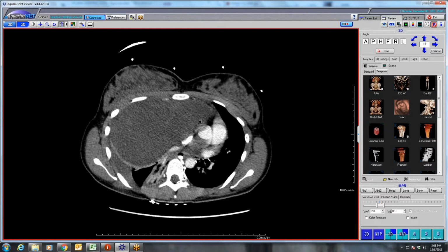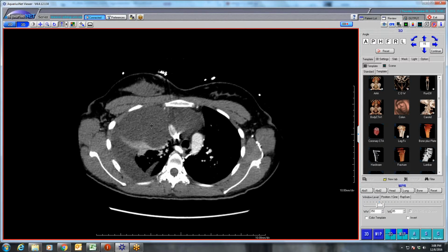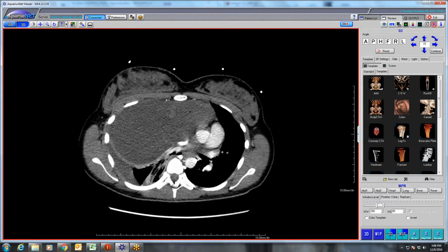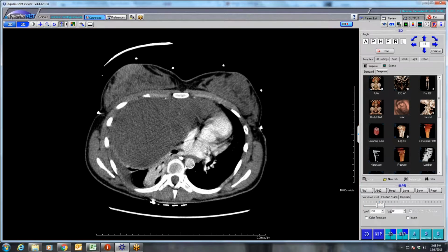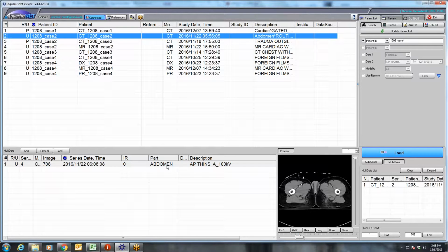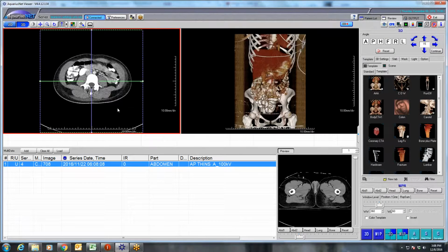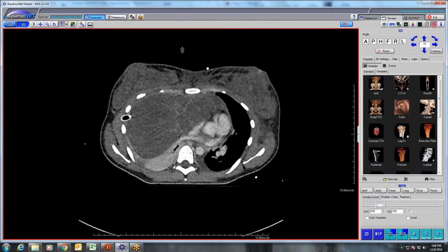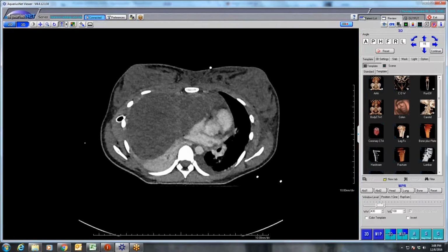on that, at least you could tell that there were some areas of just increased attenuation. There was some abnormal tissue. It wasn't just a simple cyst. There's some soft tissue within this lesion, located primarily in the anterior mediastinum, displacing the mediastinum over. This thing got extensive imaging workup. Here is an abdomen pelvis, which is nice because you could just see a little bit more of the mass, that there's some septations and some kind of soft tissue in there.